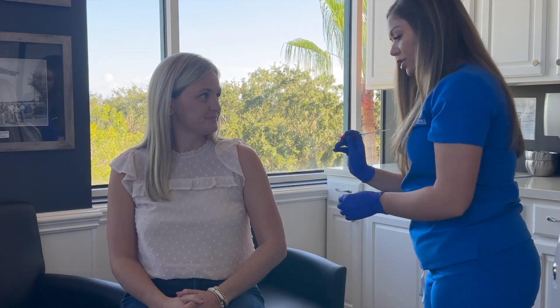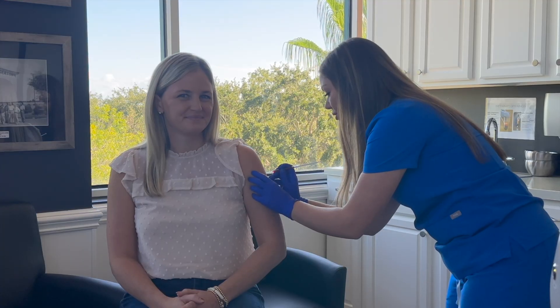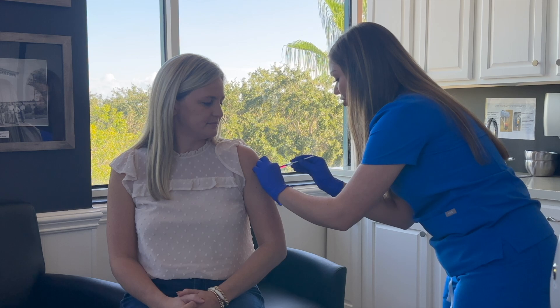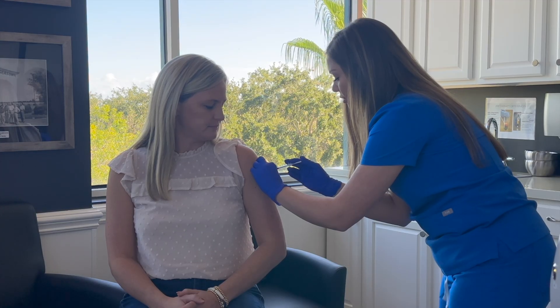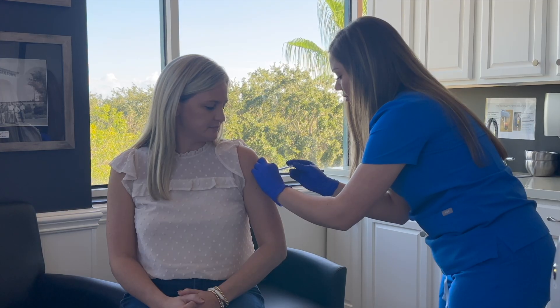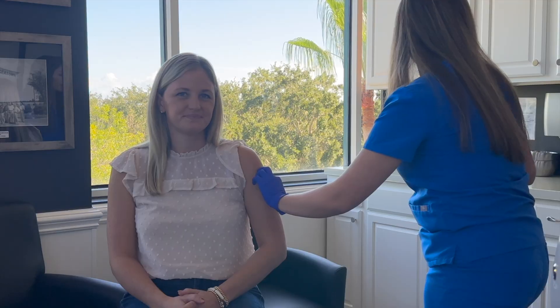When you inject, you want to go at a 90 degree angle. Then we're going to pull back slightly just to make sure there's no blood that comes back into the syringe. Then you slowly inject. Remove the syringe, and if you have any blood, you can use a gauze pad. That is it.